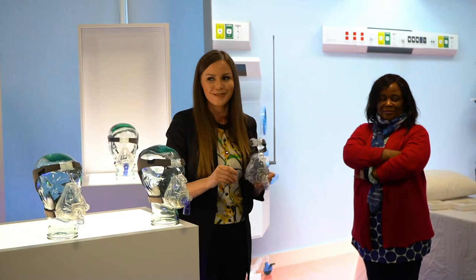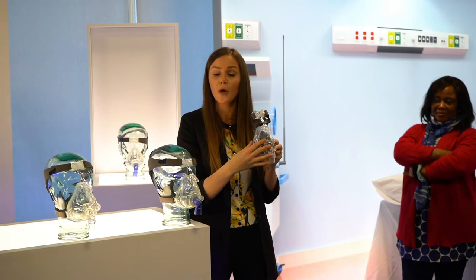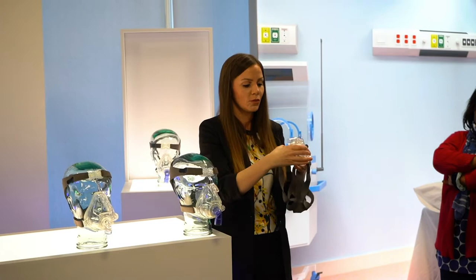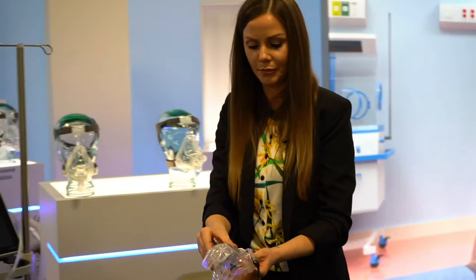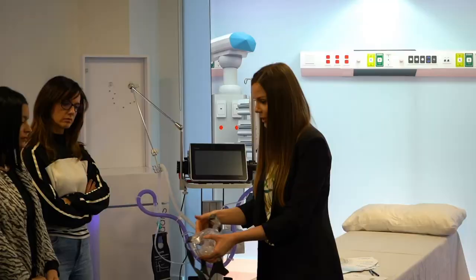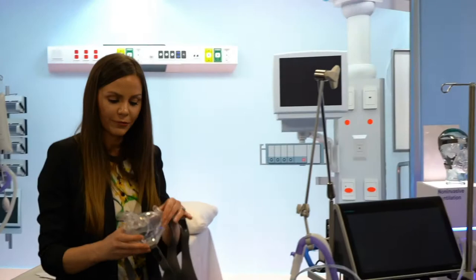So it has a 4-point headgear. 1, 2, 3, 4, okay? Nice and easy, 4-point headgear. What is that basically doing? It's distributing the pressure, when it's tightened, evenly over the patient's face, okay? It has an external frame, which is this hard plastic area here, and underneath the external frame there's a soft silicone inner mask. You see that? Would you like to touch it? Nice and soft, because that's the bit that is attaching to the patient's face. So it's made out of silicone, okay? So external frame, internal inner mask, 4-point headgear.